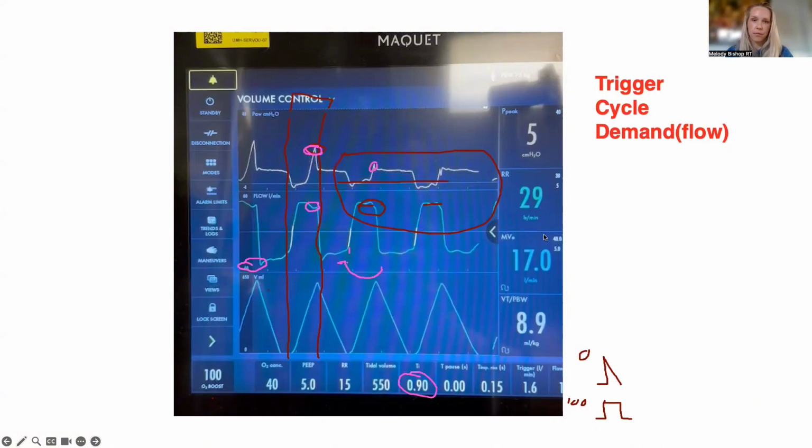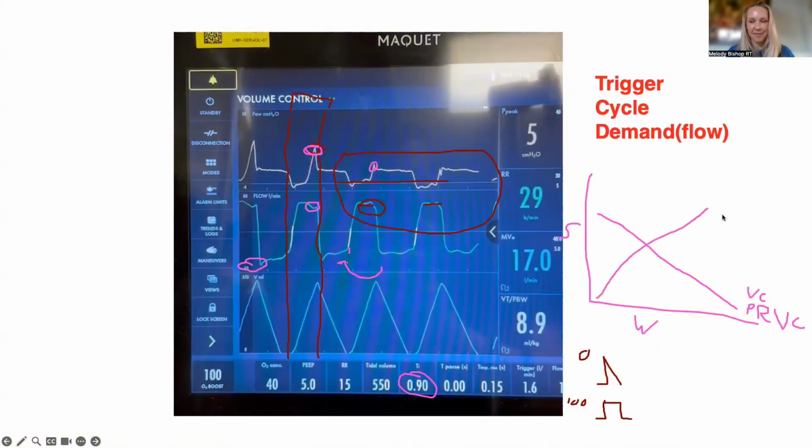As you mentioned, if you give them a little bit of fixed support, and you know this, Melody, I'm sure, but just like in the textbooks: if this is support and this is work, the support goes down as you work more. That's things like VC, our favorite PRVC. So the more you work, the more support goes down. And don't make fun of me because I can't use the mouse. The reverse of that is things like PAV and NAVA.